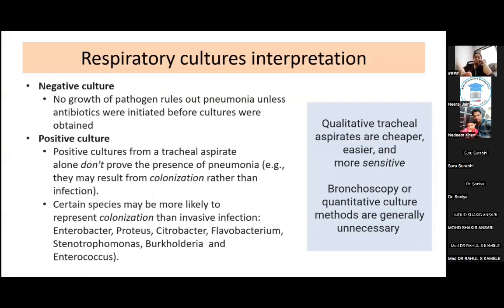So that was about urine cultures. Let's talk about respiratory cultures. Here the quantity, that is the colony count, is very important. A negative culture, meaning no growth of any pathogens, rules out pneumonia, unless antibiotics were initiated before cultures were obtained.